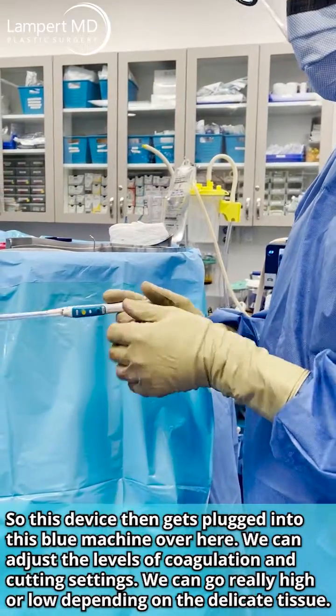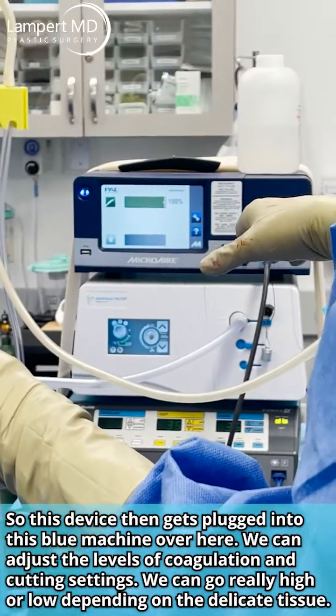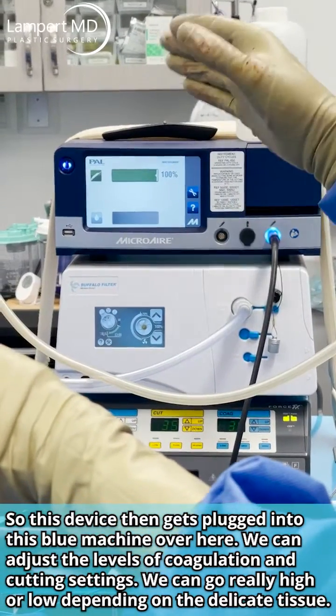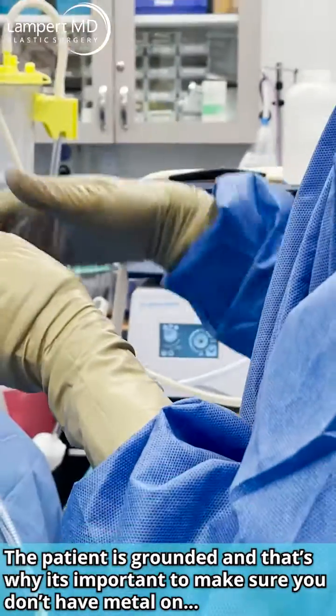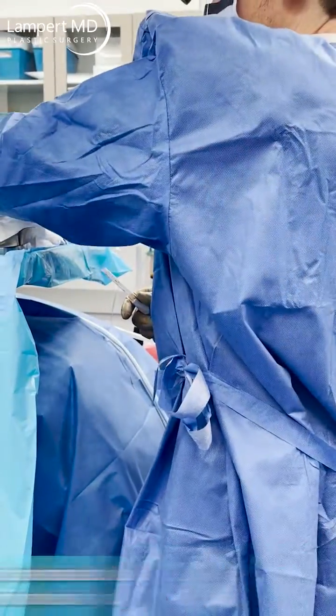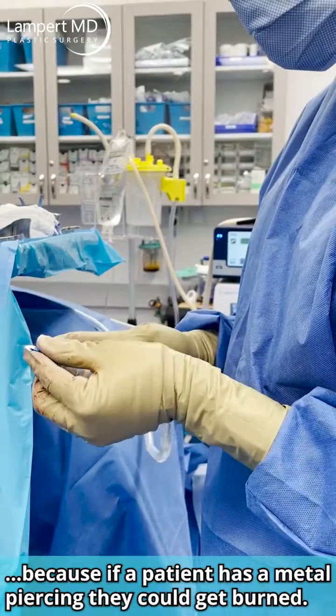This device gets plugged into this blue machine over here. We can adjust the levels of coagulation and cutting settings — really high or really low, depending on the tissue's delicacy. The patient is grounded, which is why it's important to make sure they don't have metal on, because if a patient has a metal piercing or something like that, they could get burned.